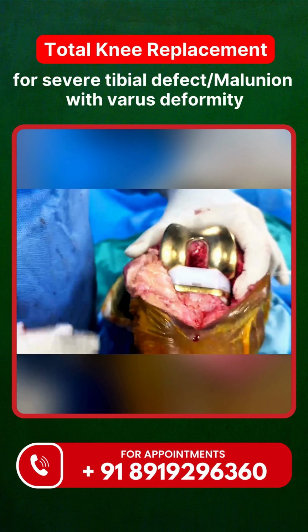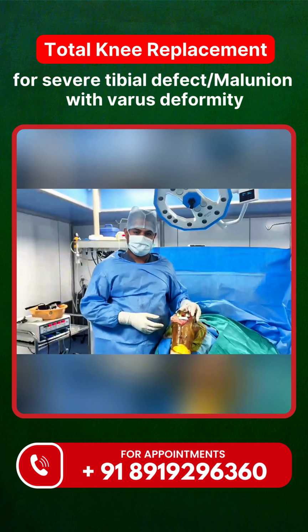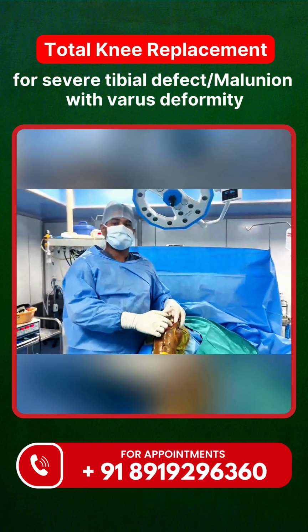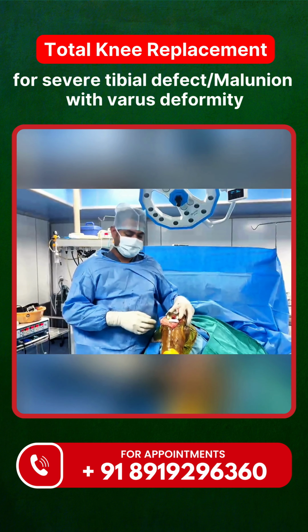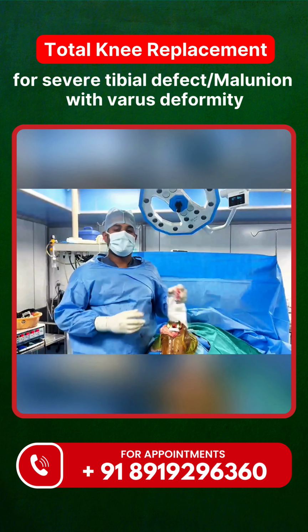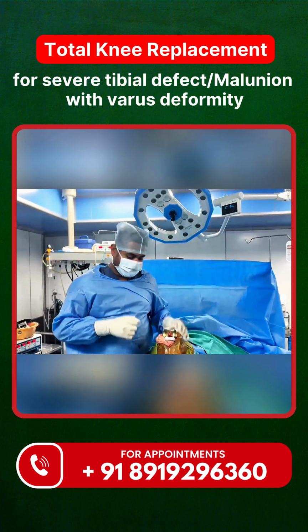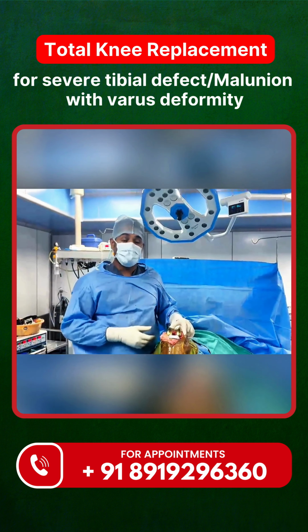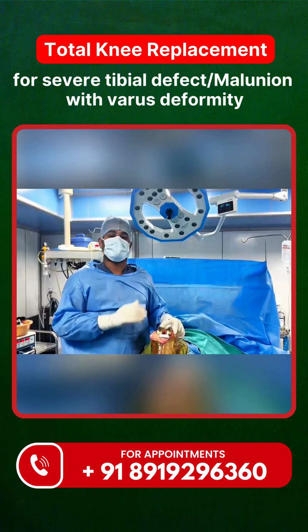On the medial tibia, we have lateralized the tibial base tray. The tray, we have lateralized it a little, and we have filled the defect with cement after drill holes because it was sclerotic bone, and the medially displaced fragment, we have chipped off as much as possible. And we have used the extension rod so that the stability of the tibial base plate increases. So this is how you do a TKR for an old malunited medial condyle tibia fracture with severe osteoarthritis of the knee.